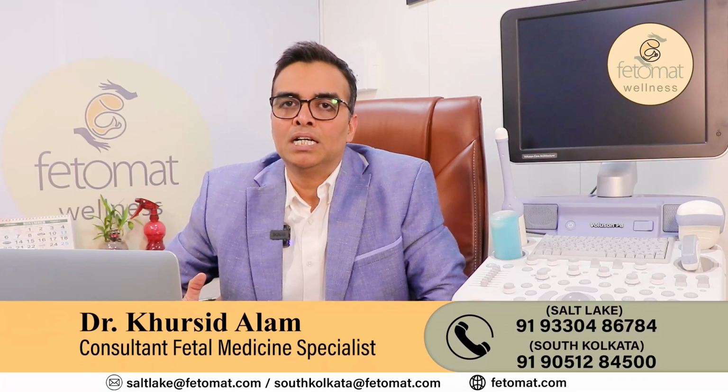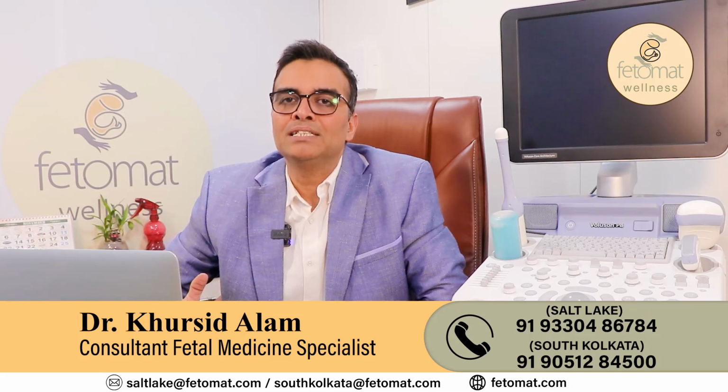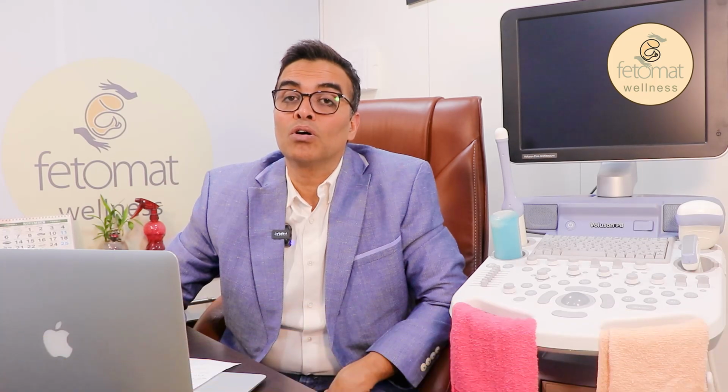Now, there should be a very good dialogue between the endometrium and the follicle. As it is said, you need a good seed, and that seed should be sown in good, fertile soil, to get the best result. And your seed is your matured follicle, and this matured follicle has several parameters based on grayscale and color Doppler, which help us to ascertain whether it is a good matured follicle or not.